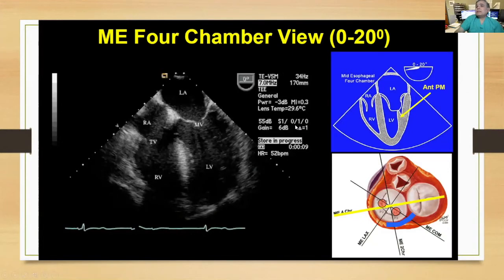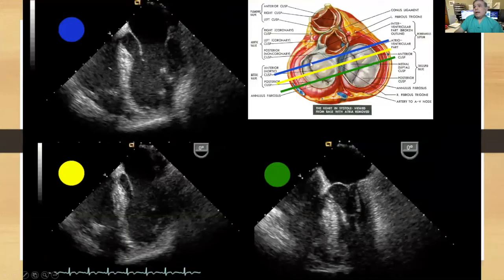The other important view is the four-chamber view, which is a pretty versatile view. From this view, approximately 0 to 20 degrees, we can see multiple segments of coaptation. Very high up we're going to see A1-P1; a little further down we'll see A2-P2; and further down deeper we'll see A3-P3.